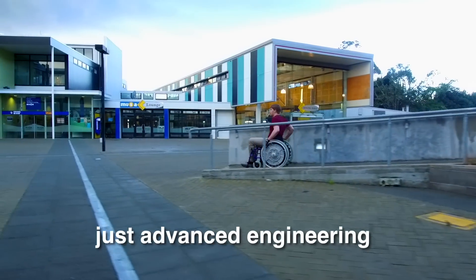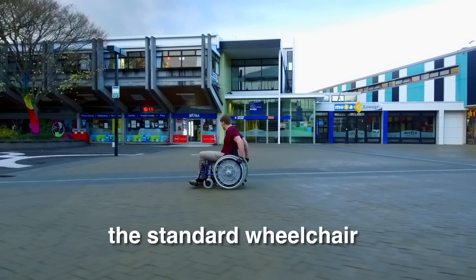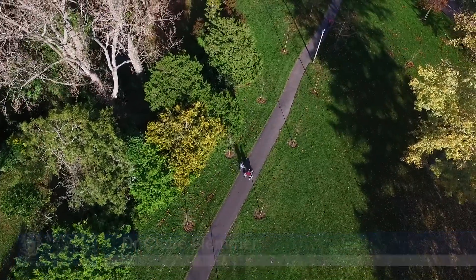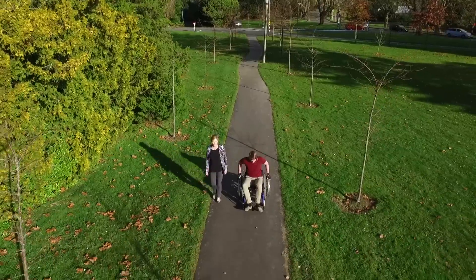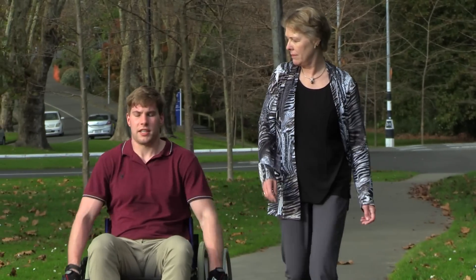But for 1% of the population, there is little other choice. Until now. Dr. Claire Flemer of the School of Engineering and Advanced Technology decided the standard wheelchair needed an overhaul. It started about 30 years ago when Rory and I were watching a lady really struggling to go up a wheelchair ramp, and we looked at her and thought it's really crazy that wheelchairs haven't changed in their design for pretty much 100 years.